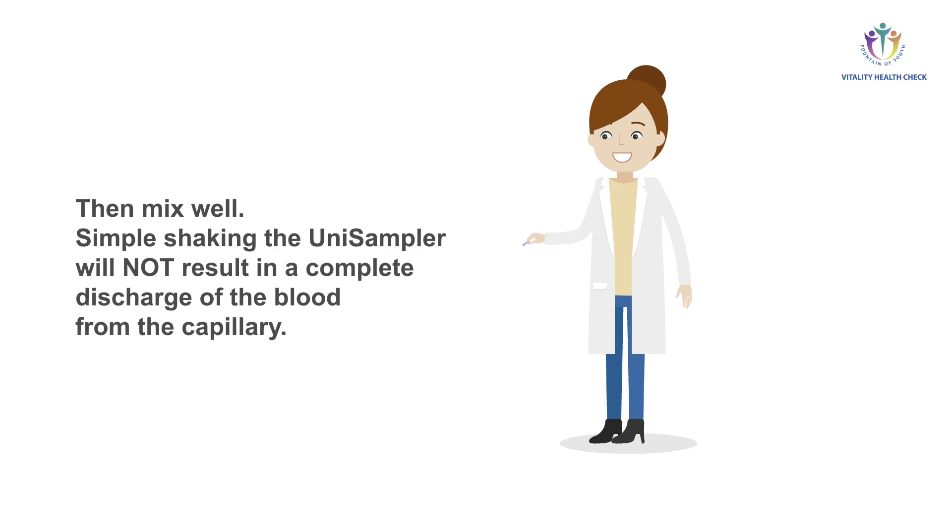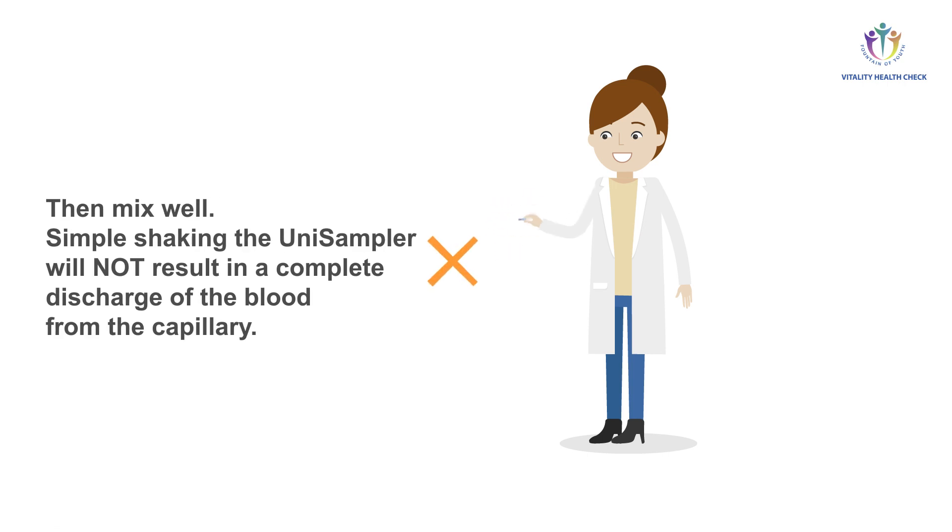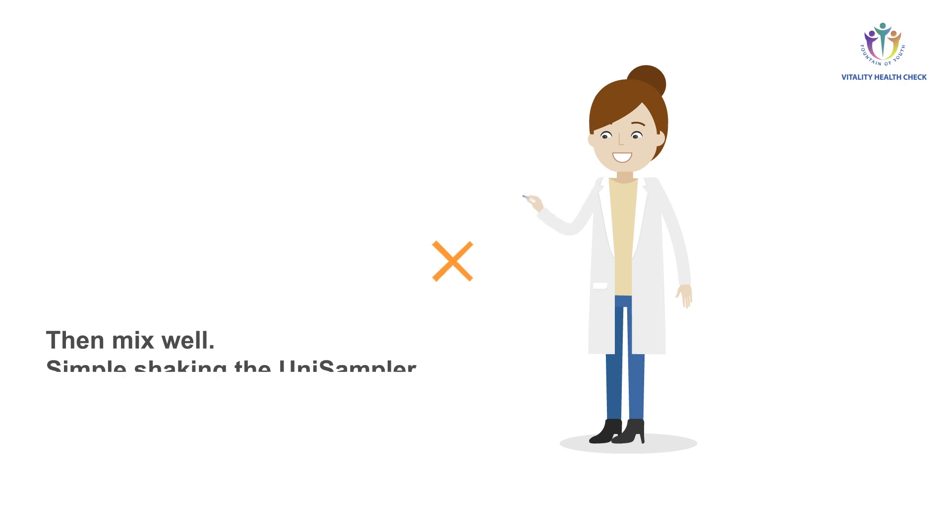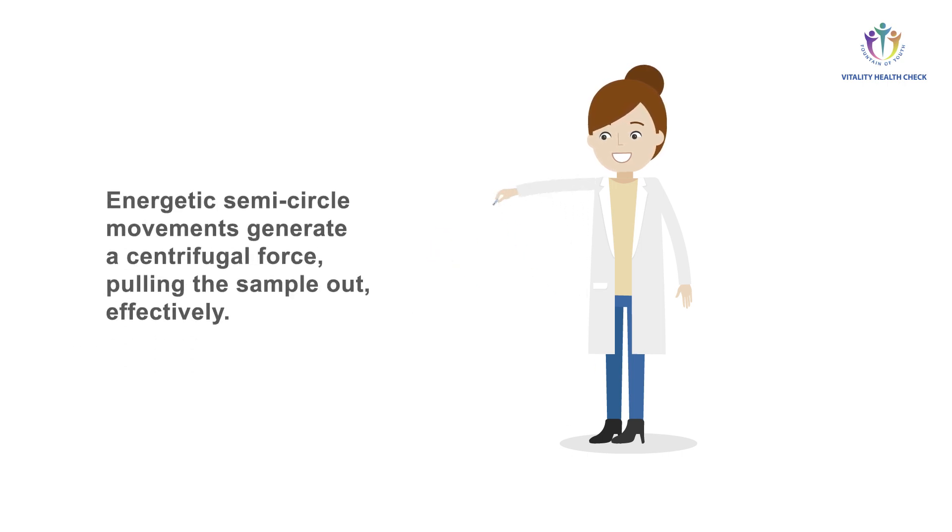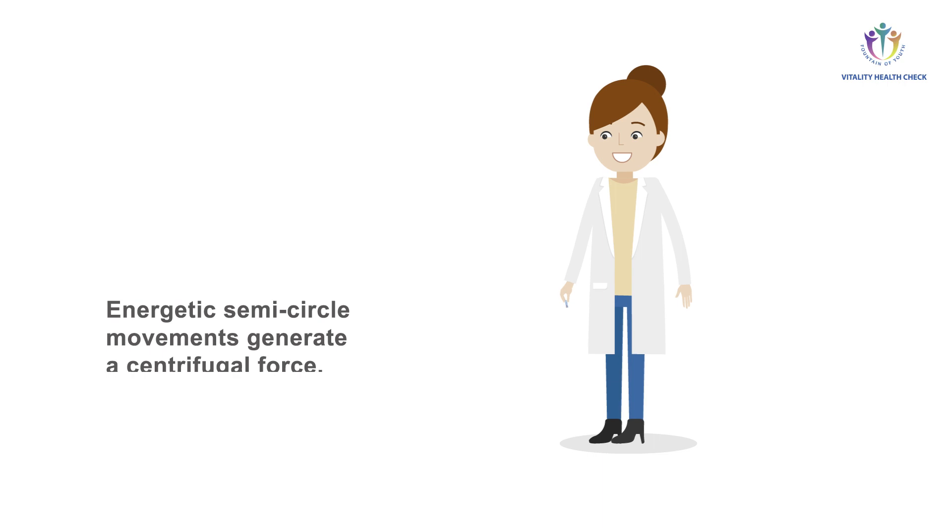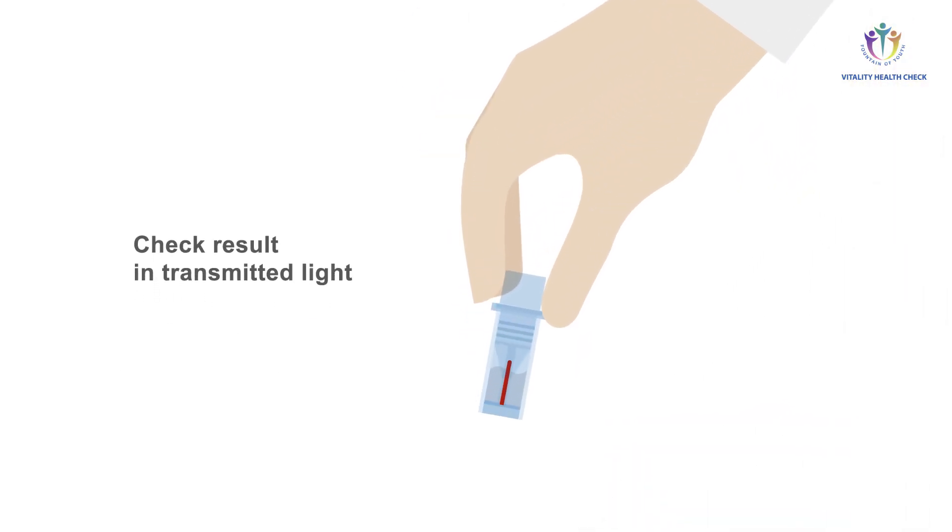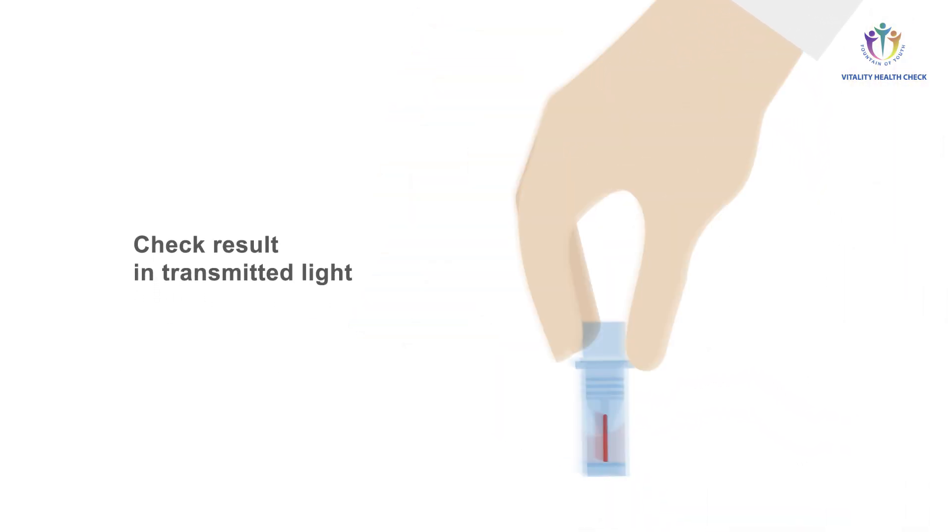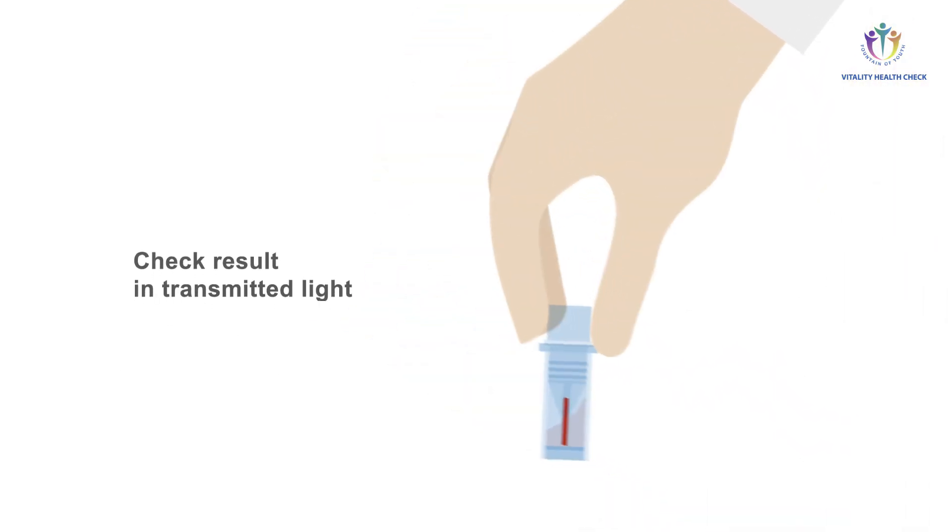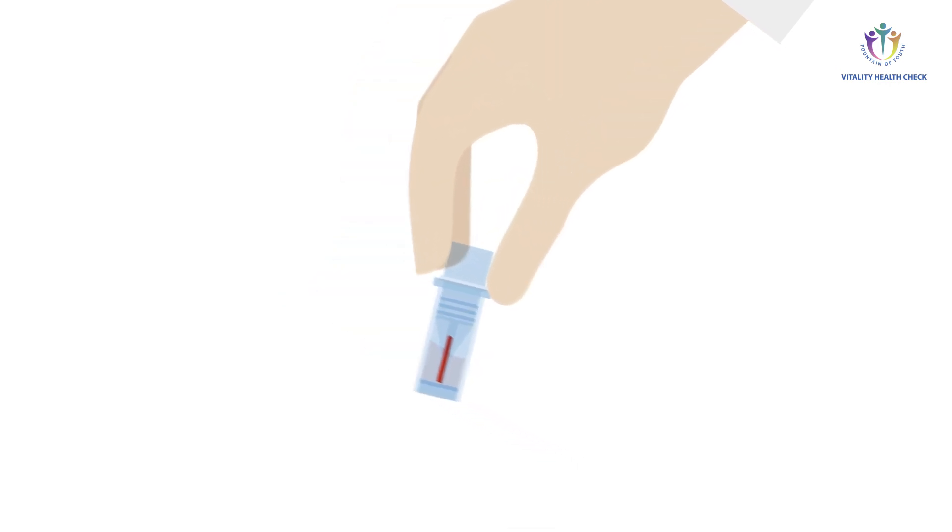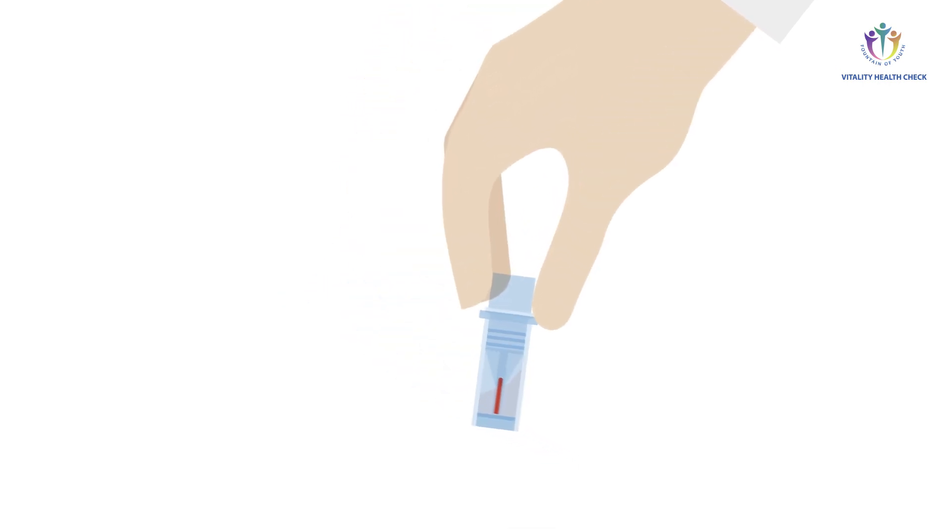Simply shaking the uni-sampler will not result in a complete discharge of the blood from the capillary. The energetic movements generate a centrifugal force directed to the bottom of the uni-sampler, which pulls the sample effectively out of the capillary and directly into the buffer. Check the result in transmitted light. Evenly mixed? Repeat mixing until this is achieved.